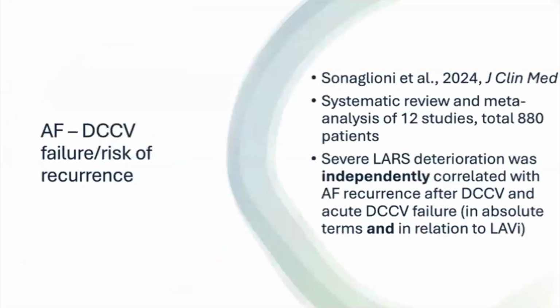And lastly, I just wanted to talk about the potential role of left atrial reservoir strain in atrial fibrillation, and specifically about its ability to predict the chances of achieving success in restoring a sinus rhythm.